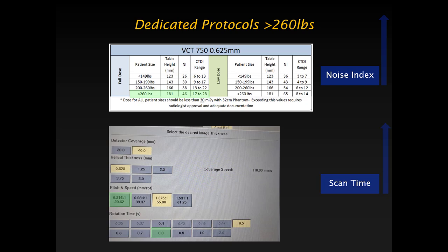Now, for us, we don't do this because, frankly, we have close to 100 to 200 protocols per scanner, and we have 20 scanners. That's already a massive number. If we had to multiply that by four, it would be very cumbersome to optimize when we need to fine tune, make changes, and access the systems. It would just take a lot longer. And from a managerial perspective, it's not feasible.